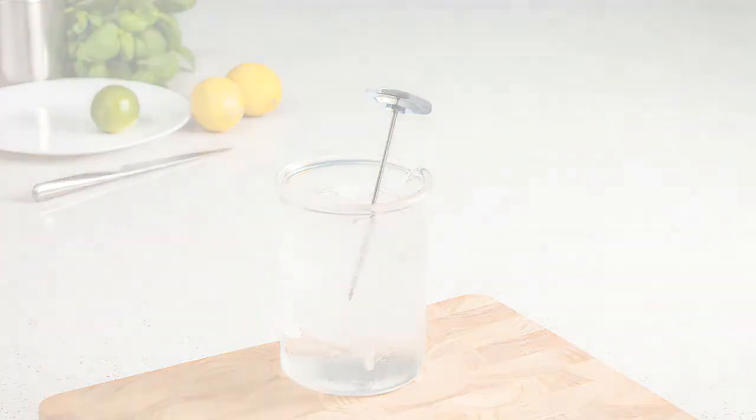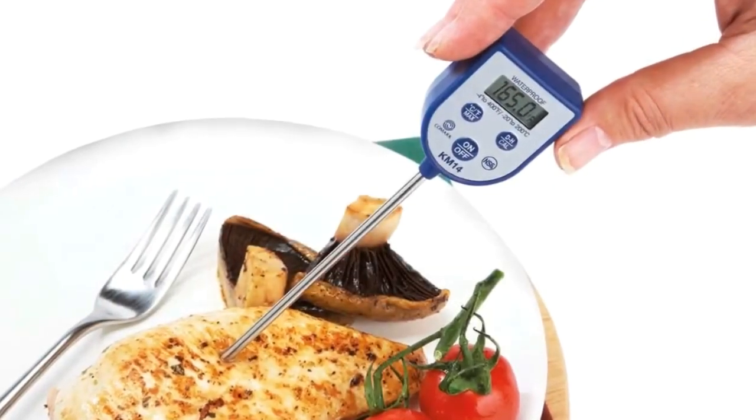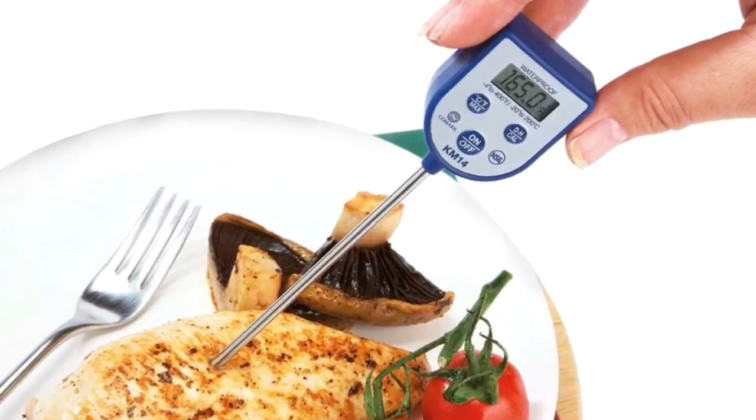Once complete, remove your thermometer from the crushed ice solution and continue to take measurements as normal.